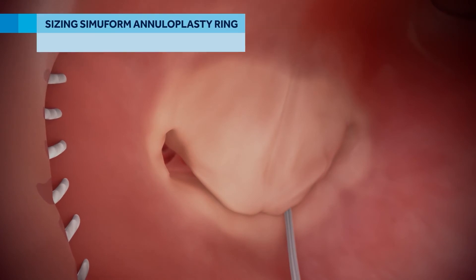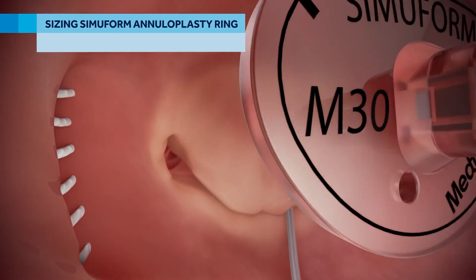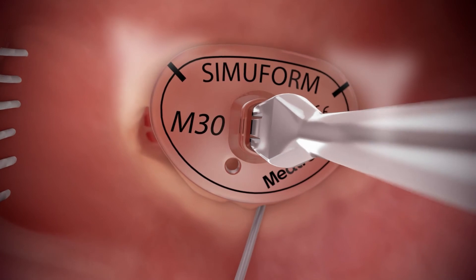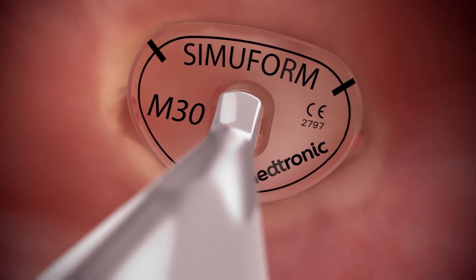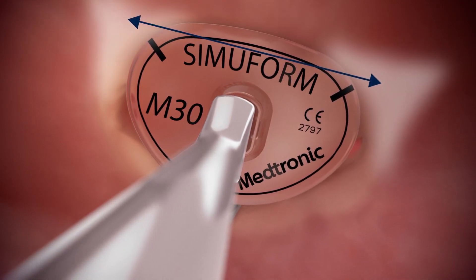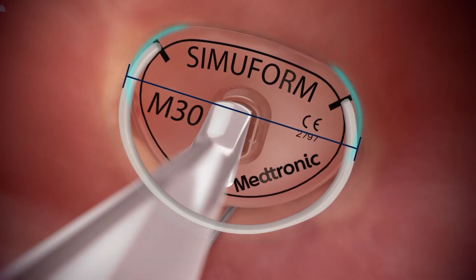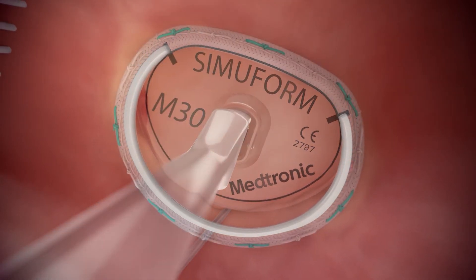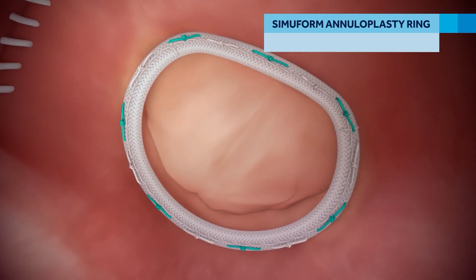To determine the proper SimuForm semi-rigid annuloplasty ring size to implant, lower the sizer onto the valve annulus and align the trigone markers on the sizer with the trigones. Determine the appropriate mitral ring size by locating the sizer with a trigone marker spacing that best corresponds to the intertrigonal distance. The outer edge of the sizer corresponds to the stiffener of the ring and shows where the ring will sit on the annulus. SimuForm rings are sized using intertrigonal distance.